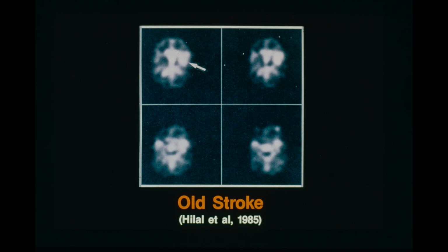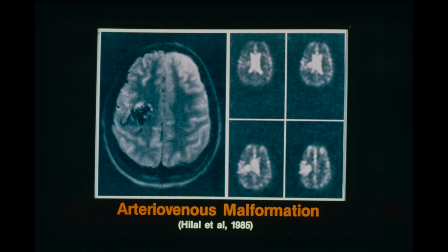Same patient who was going to be examined anyway to look at an old stroke, which we can see right here. AVMs, typically these are seen as black in a proton image, but it's not fully perceivable from the image as to how much damage there actually is. In the sodium image, we can see that this extends very much farther than what we see in the proton image. So it's believed there may be some applications of sodium.